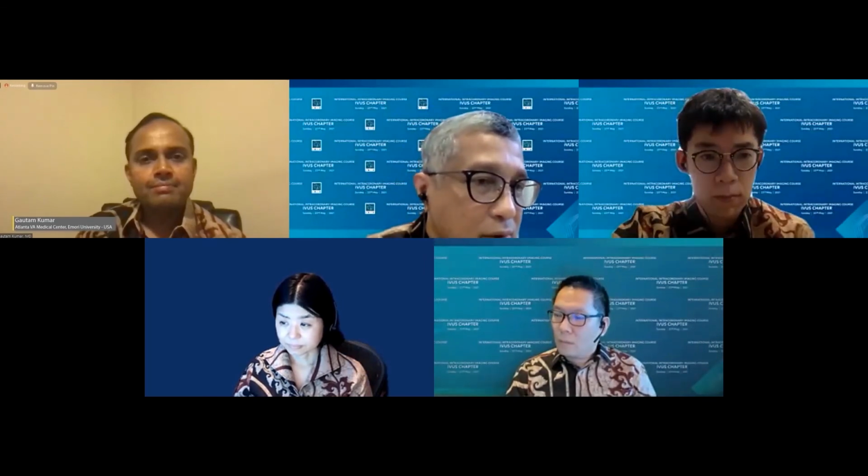Thank you, thank you. So in NUH, Juan, what do you think? You have both, right? You have laser, if not mistaken, or you also have lithoplasty right now. No, we don't have laser in Singapore. It's just a shockwave balloon, lithotripsy and orbital atherectomy. But a very nice case, very nice demonstration. In a situation like that, nowadays with lithotripsy, I think it will be my first tool to use when I have an underexpanded stent.